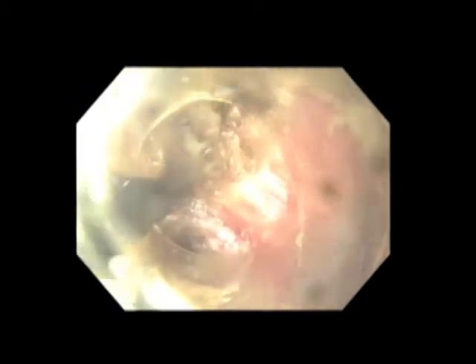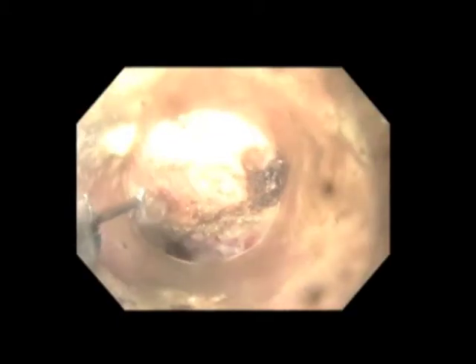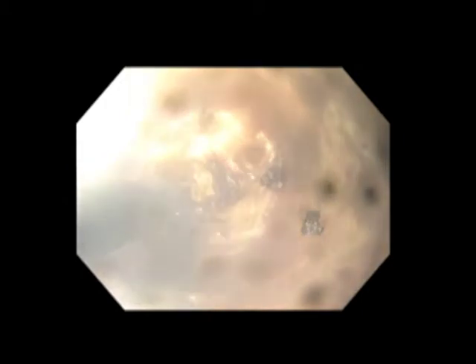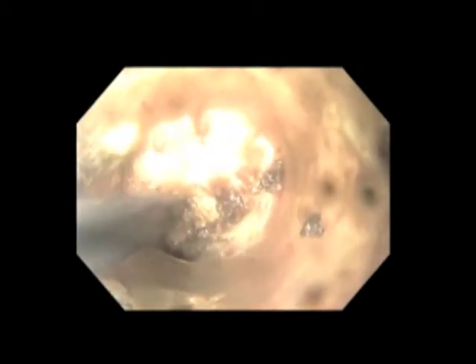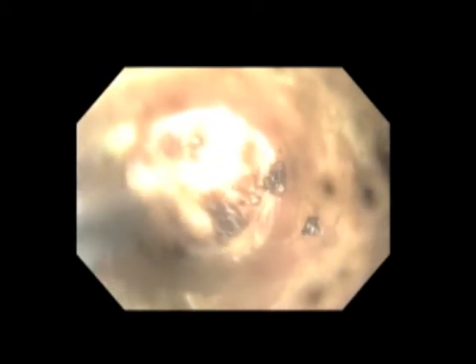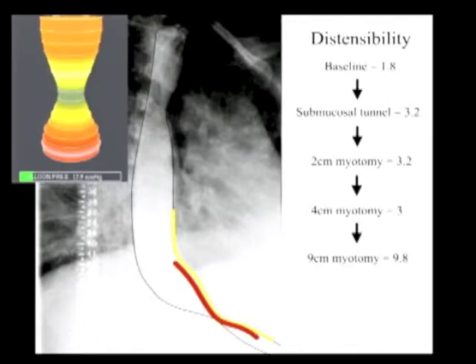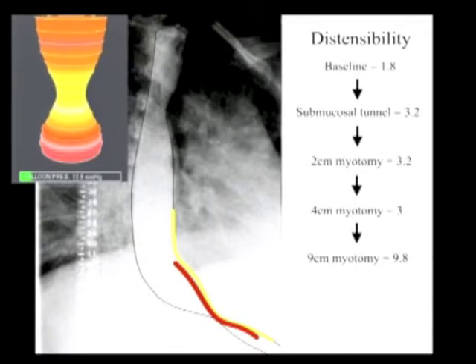The myotomy is now extended the remaining two centimeters proximal to the EGJ and then three centimeters distal to the EGJ and onto the stomach. At this point in the dissection, the muscle fibers become more disorganized and selective hooking of individual fibers is often no longer possible. At the level of the EGJ, muscle division must proceed slowly in order to avoid both mucosal injury and full thickness perforation into the peritoneal cavity. With the myotomy complete, we take a final FLIP measurement. We can see that this final segment has resulted in a greater than three-fold increase in distensibility. Reassured by this quantitative assessment of EGJ physiology, we proceed with clip closure and completion of the procedure.